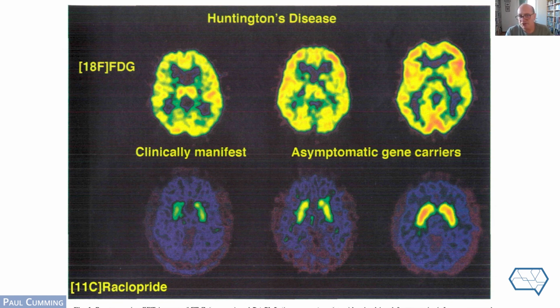And that is indicative of the degeneration of the neurons of the striatum, which bear the dopamine receptors. And in fact, I would go further to say that asymptomatic carrier number 1 is halfway on the road to Huntington's compared to the right-hand-most person who seems to have a much more intact basal ganglia. So that's interesting because we can see separate channels, energy metabolism in the upper figure and dopamine receptor binding in the lower figure. And both of these changes, degenerations, seem to occur in parallel.